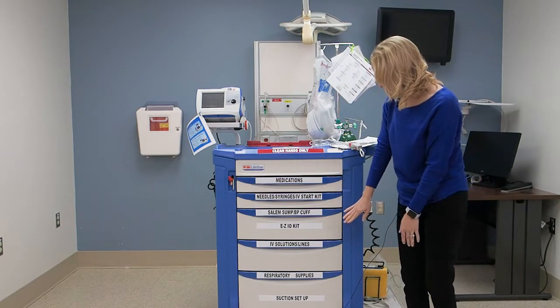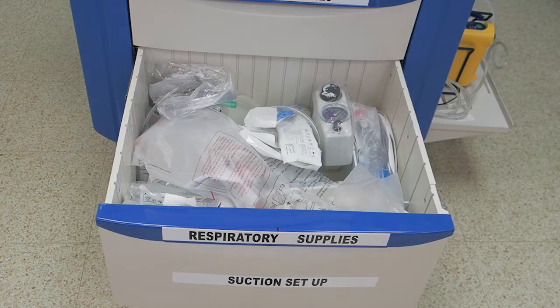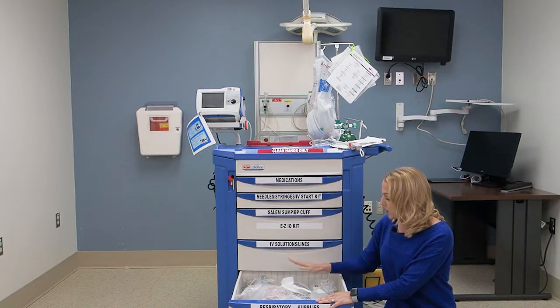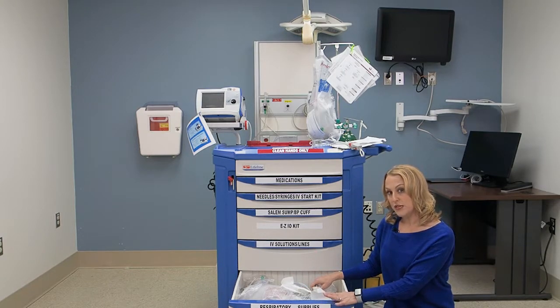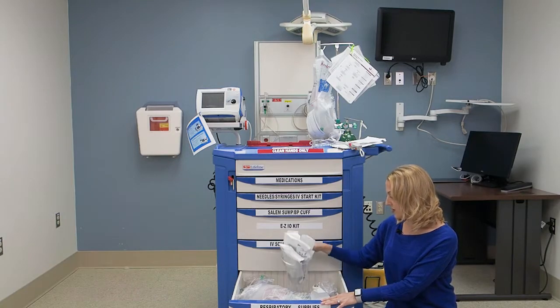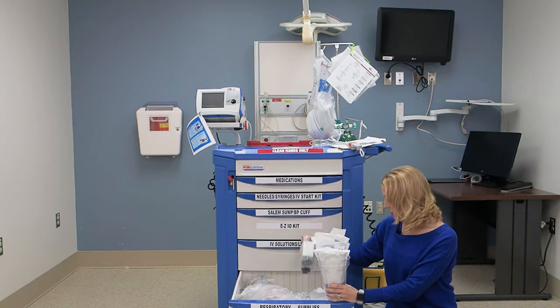The bottom drawer is just as labeled, respiratory supplies and suction setup. And in that drawer, you're going to find an extra ambu bag, things that you would need in case of intubation, including things to secure an ET tube, suction catheters, all of your tubing for oxygen. You have a face mask if you should need it, lots of extra respiratory supplies. You do have in this drawer suction equipment. This would be used if you need to place it into the actual wall. So you have a suction setup, and then you have an actual wall suction regulator that you can use if you need to use it.